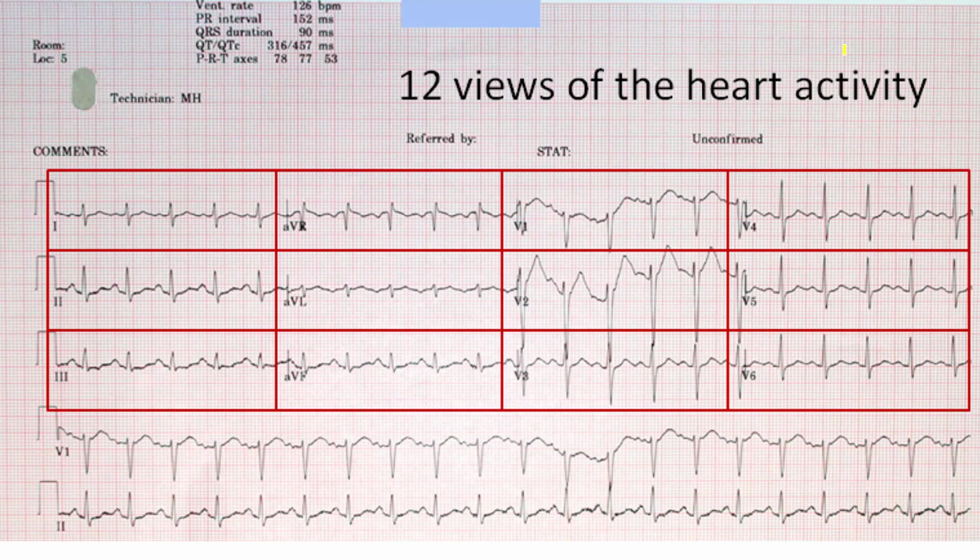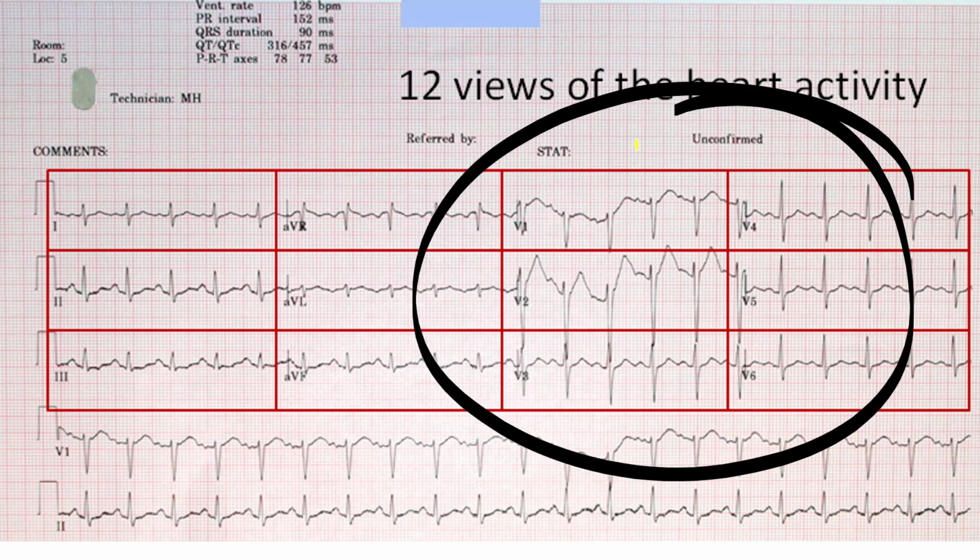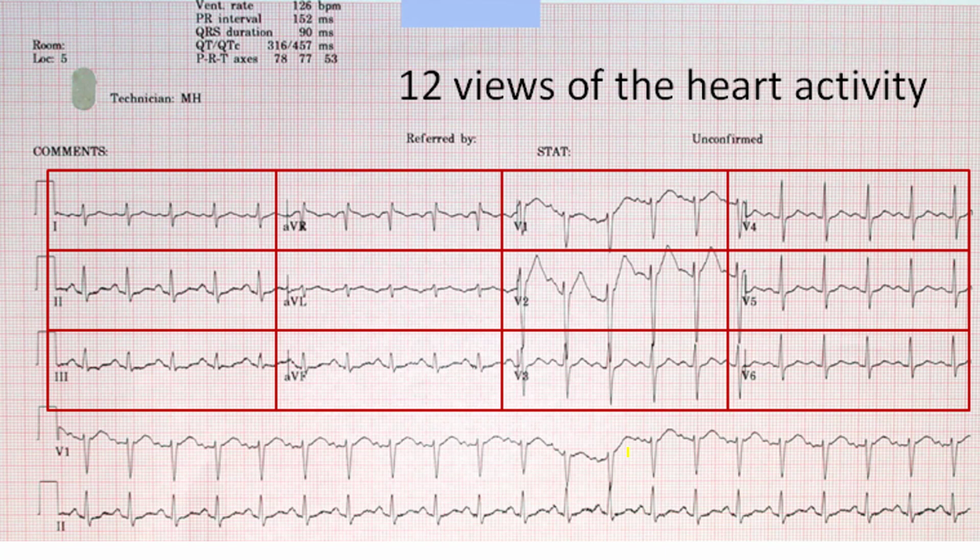Okay, if you look at a 12 lead ECG, you'll notice those chest leads. Sometimes they're called precordial leads. What are those for?